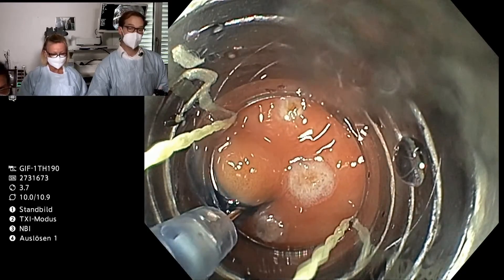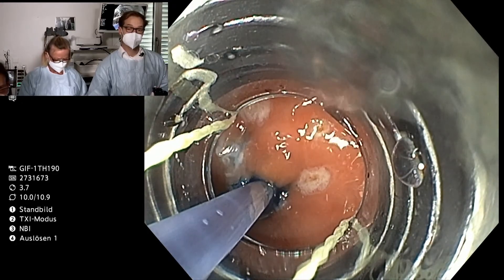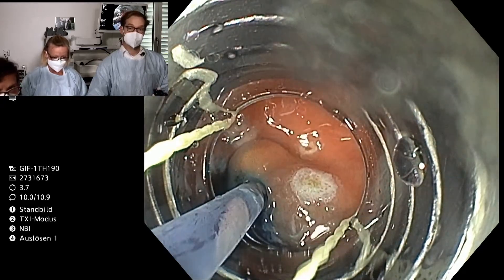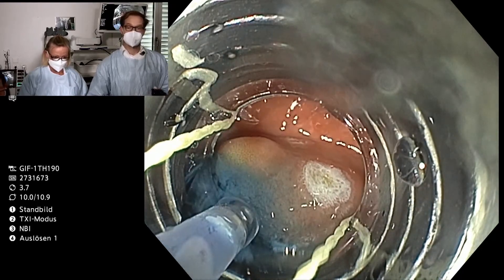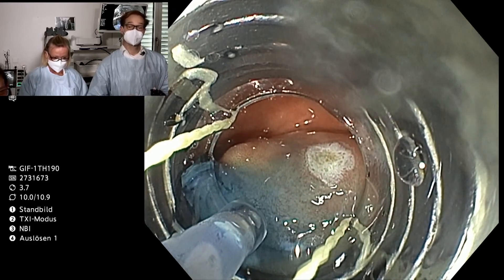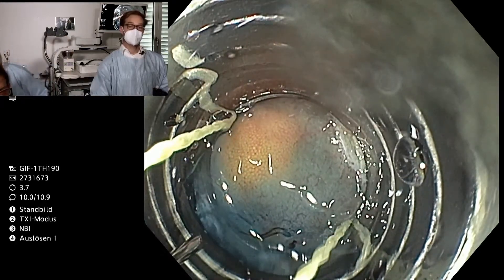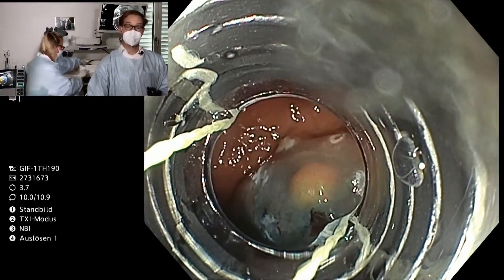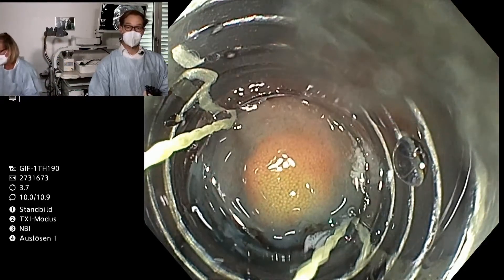I am trying to get below the lesion and place the injection just a little below. Now we are injecting, trying to inject around 5cc. You can see a very nice lifting of the lesion — going a bit back, you see nice lifting here in the center of the lesion, and the lesion came up with the lifting.